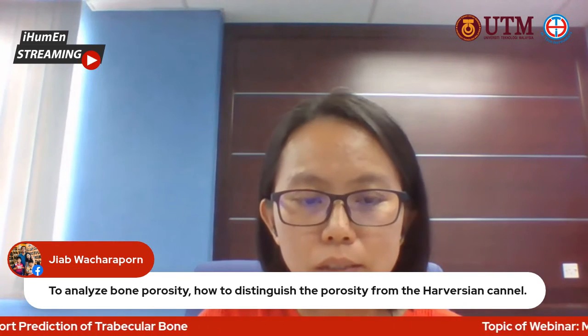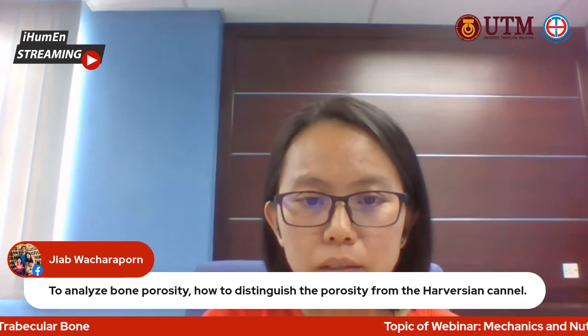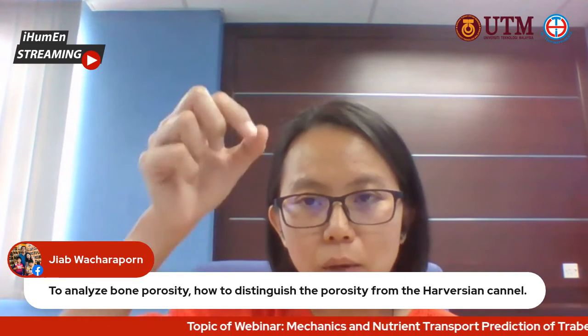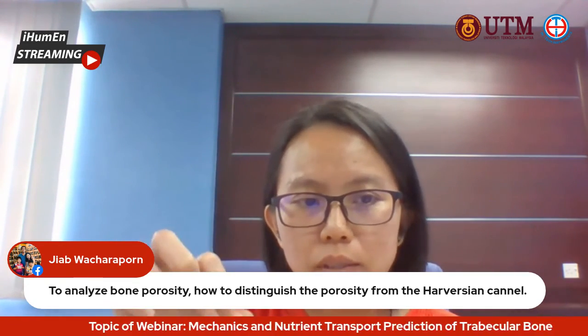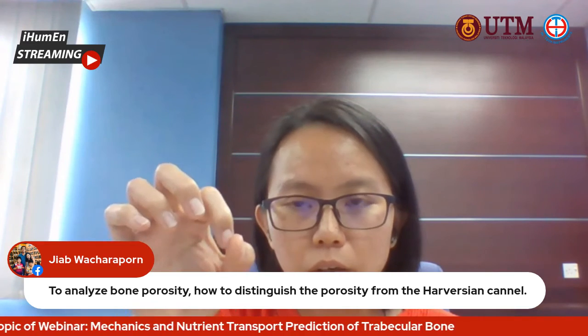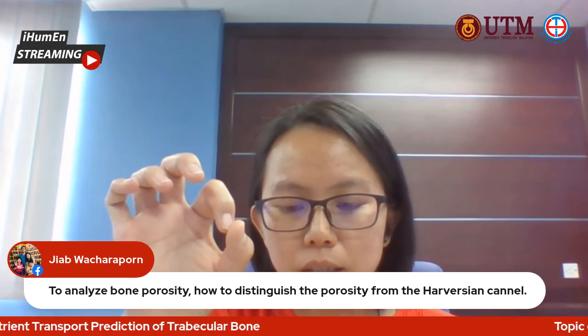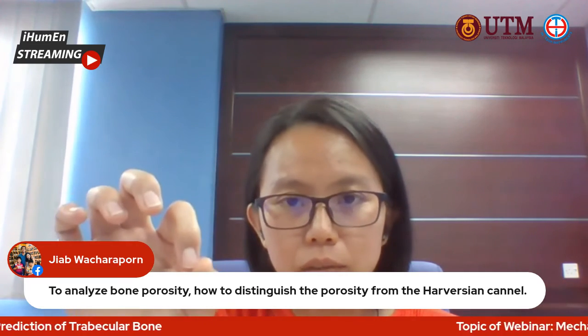To answer your question, how to differentiate between the bone porosities and the Haversian canal, it's mainly based on the structure. The Haversian canal is tube-shaped, a network, whereas the porosity of the cortical layer has pores of irregular shape.